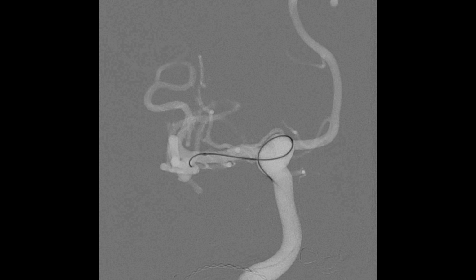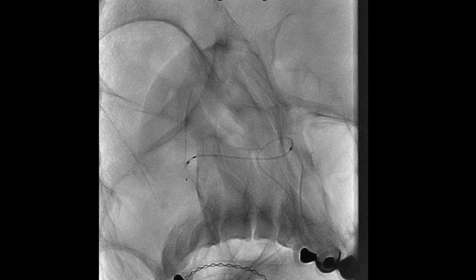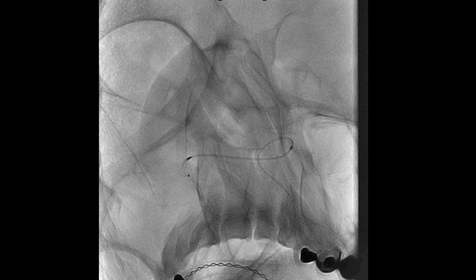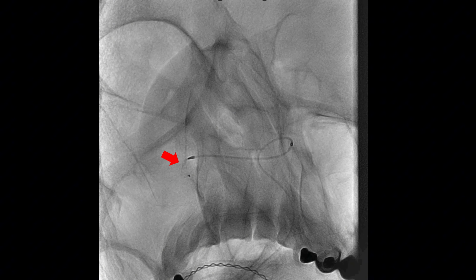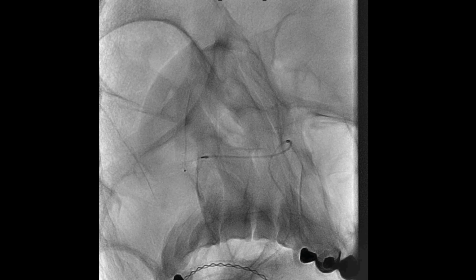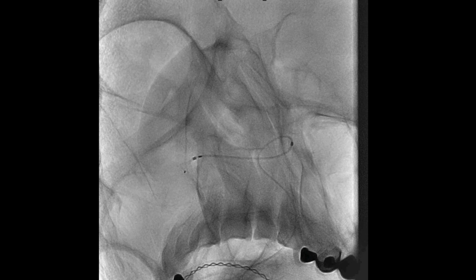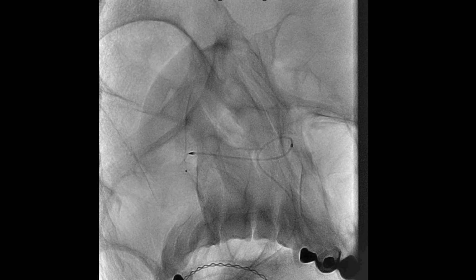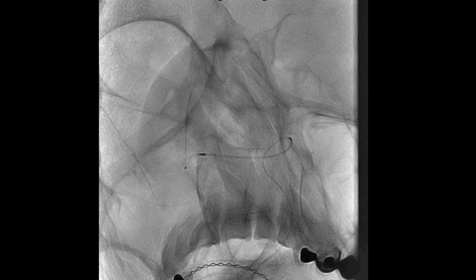Here's another classic case where pushing too hard after the distal end fully expanded caused stubborn web folding. Notice how the device buckles and resists unfolding. Watch how it took multiple attempts to finally get the device to unfold completely. By anticipating this folding risk, we can adopt a preemptive approach to save time and prevent frustration later in the procedure.